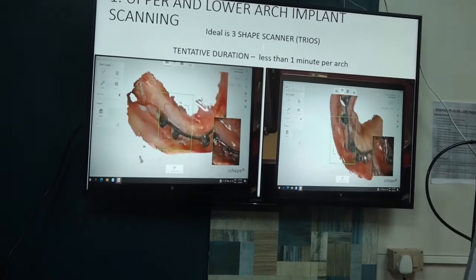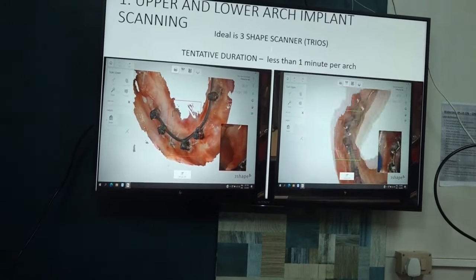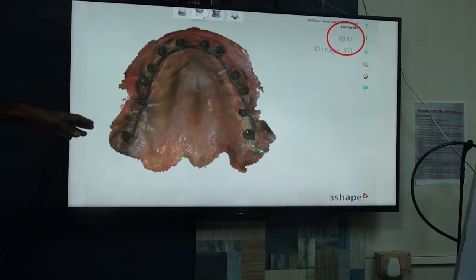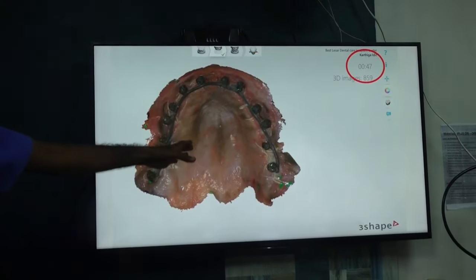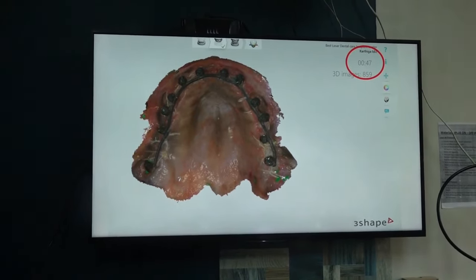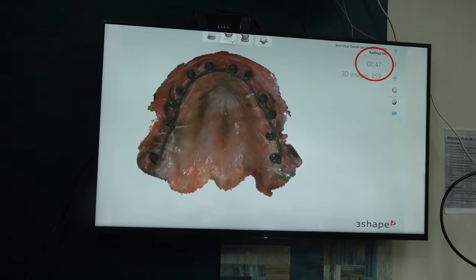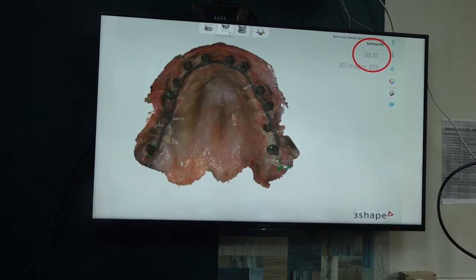Just imagine the slide we discussed before, what direction you have to come. When you are doing the upper scan, the palate also will come. Palate also should come. The palate will be used in a later stage. Okay, see the total scanning time, it is 47 seconds only, even with the palate. So actually it won't take more than 1 minute.